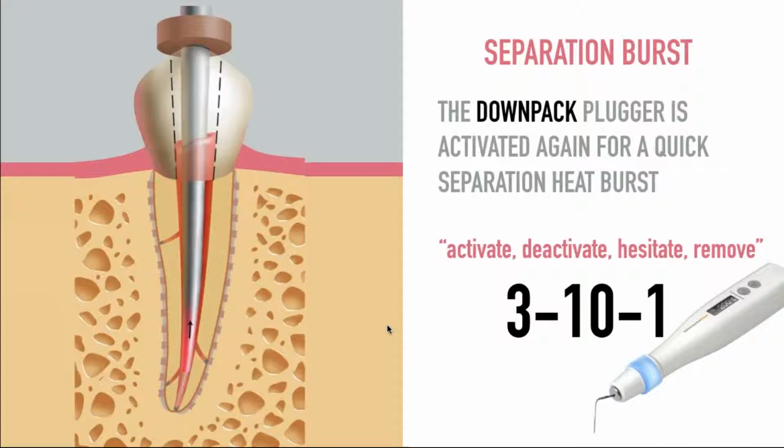Use the mnemonic, 3-10-1. 3 seconds to downpack, 10 seconds.